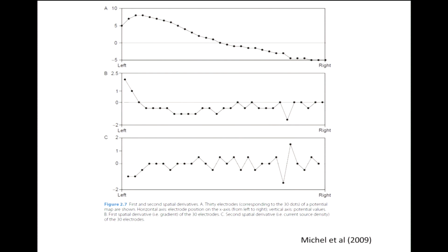Accordingly we don't just subtract activity from only one neighbor, but from a group of neighbors, and depending on your selection of neighborhood this subtraction would change, but the procedure is the same. You select a neighborhood, calculate the mean activity of the neighborhood, subtract this mean activity from your selected electrode, and do the same thing in the second round again.